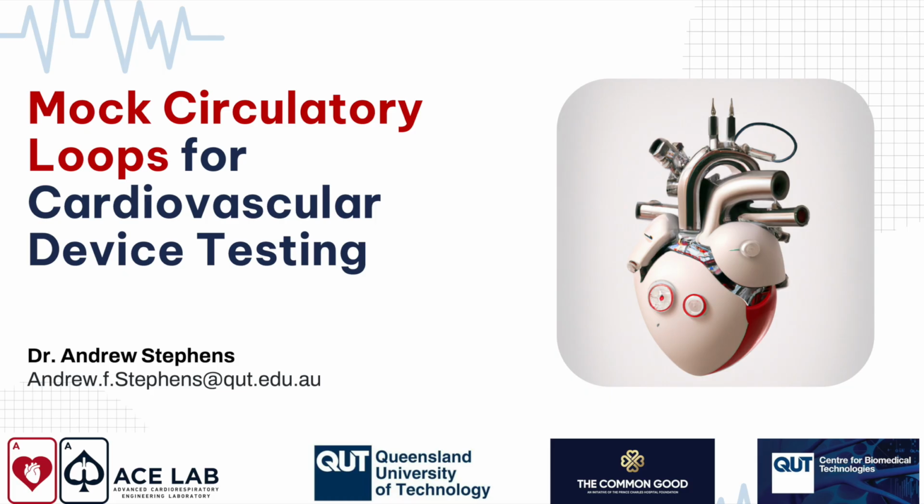Do I need it for a continuous flow TAH? You need even less. So obviously no heart. You probably don't need a sophisticated control system for your mock loop because it's just going to be a bunch of pipes on the bench. Compliance actually won't change the response of your mock loop very much, except when you're changing speed. When you're in a steady state, compliance actually does nothing.